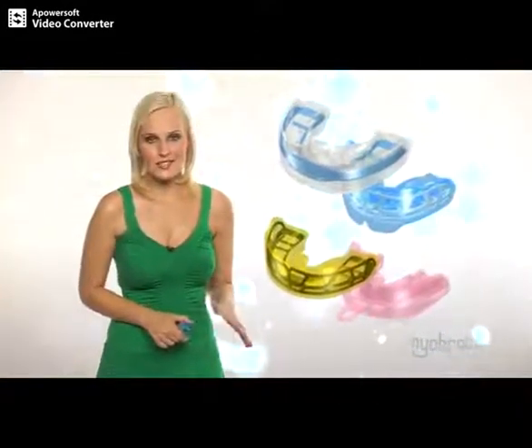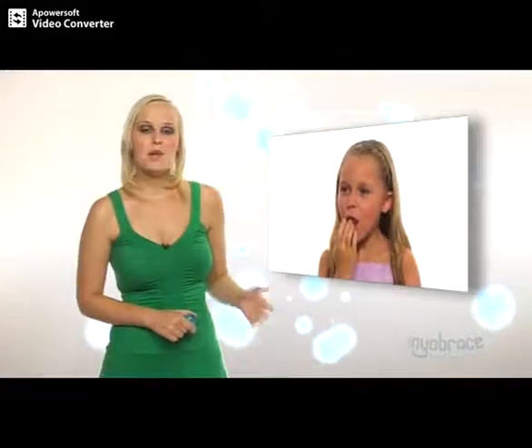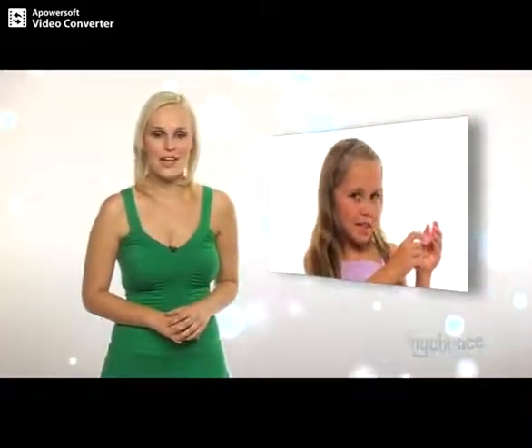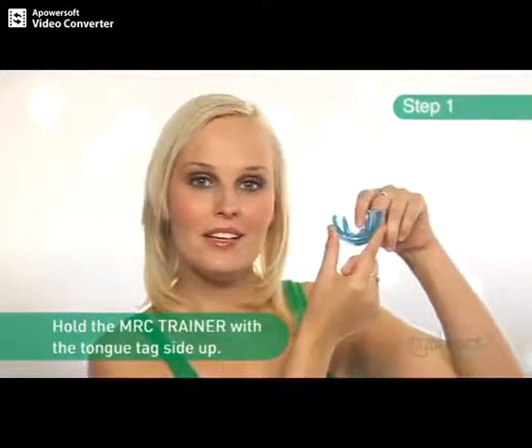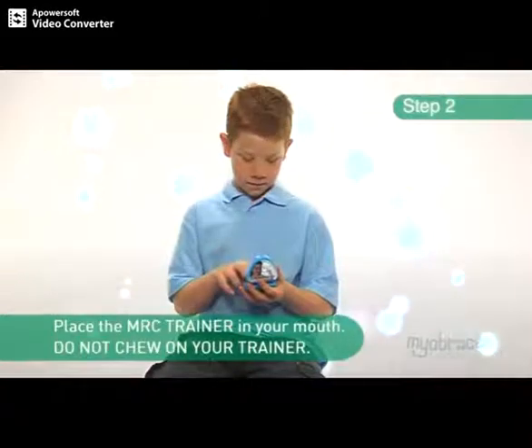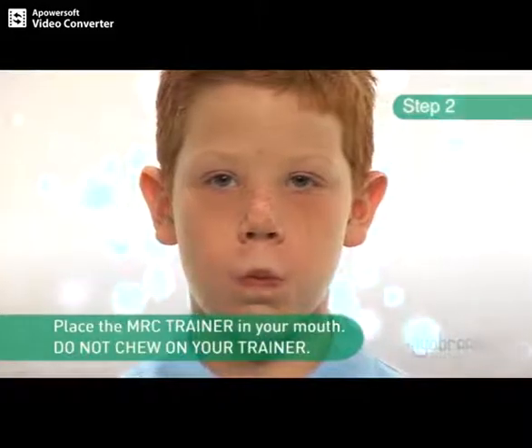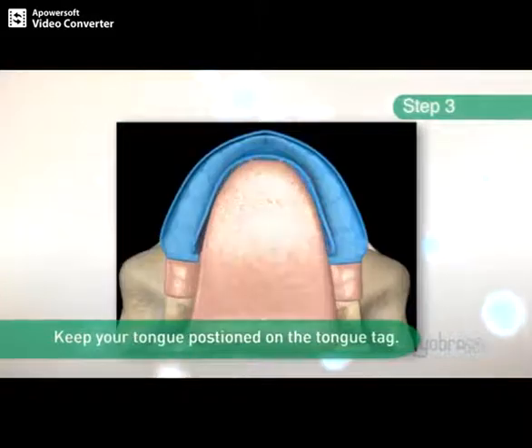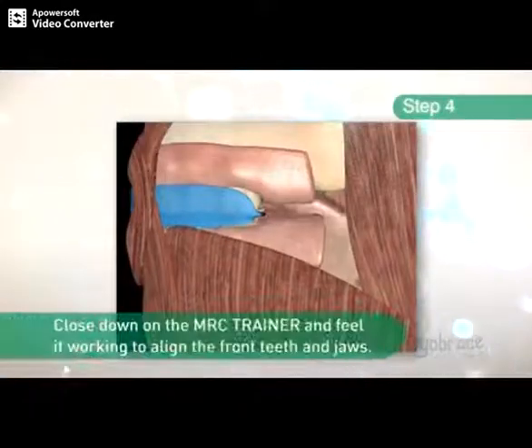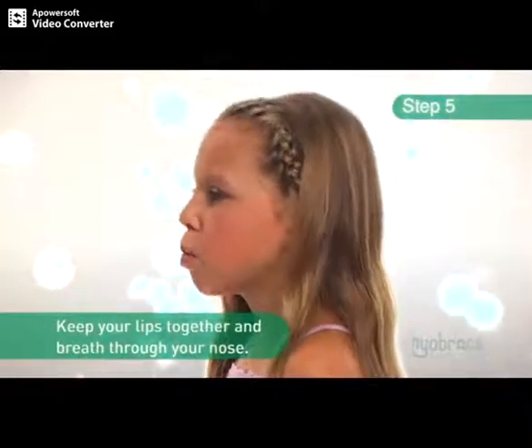All appliances in the trainer system are designed to help retrain the oral muscles while straightening the teeth. Here we will show you the basic instructions on how to use the MRC trainer. Step one, hold the MRC trainer with the tongue tag side up. Step two, place the MRC trainer into your mouth. Step three, keep your tongue positioned on the tongue tag. Step four, close down on the MRC trainer and feel it working to align the front teeth and jaws. Step five, keep your lips together and breathe through your nose.